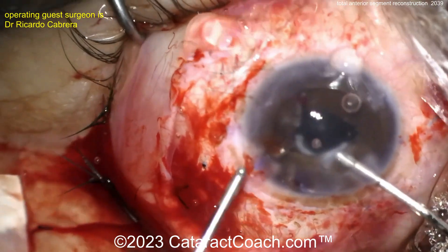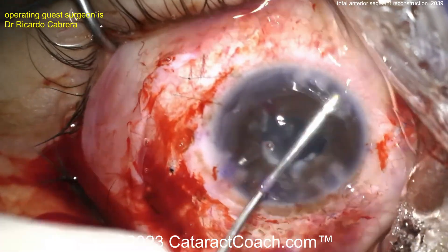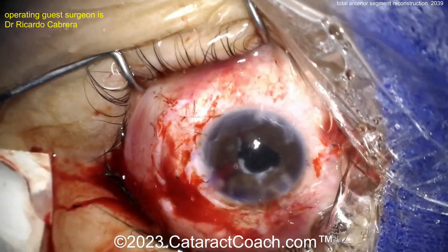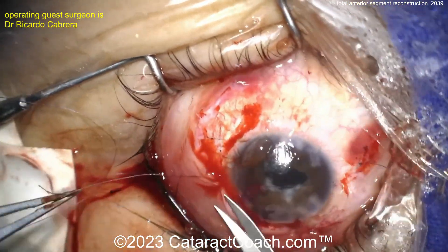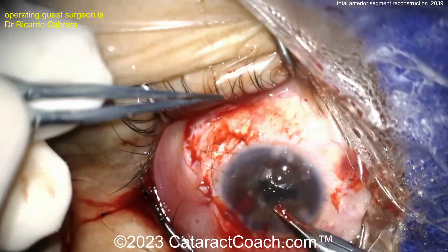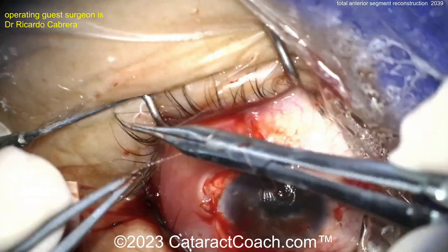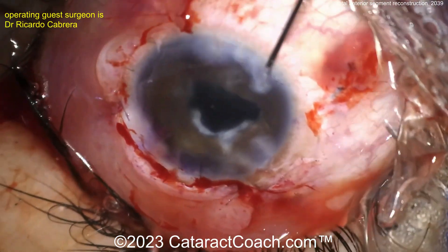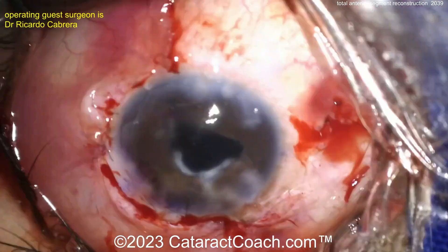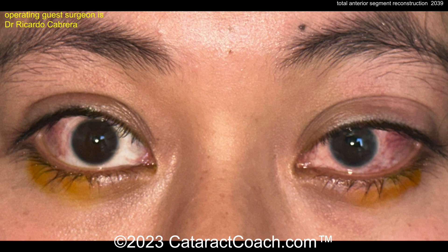There's the glaucoma valve being placed — pars plana. He's cleaning up the anterior segment. That's a beautiful case. The patient will take some time to recover — a month, two or three — in post-op recovery. But you've got to admit, that is just a beautiful surgery. Very, very talented surgeon. Thank you so much for sending this video to me — I enjoyed watching it. Let's see the post-op. Wow, beautiful. Fantastic result. And cosmesis too.